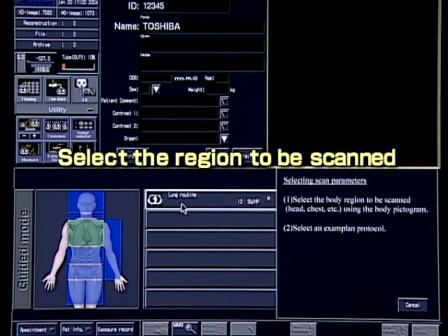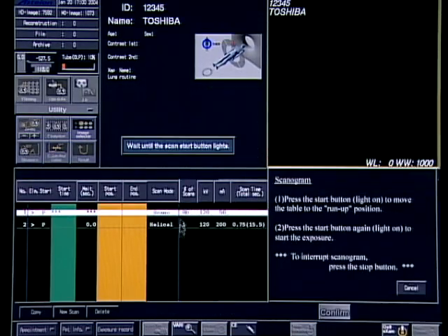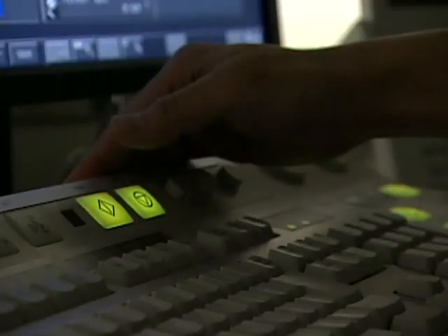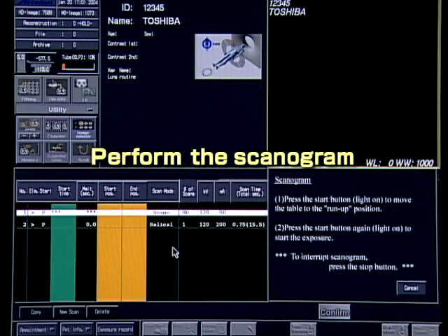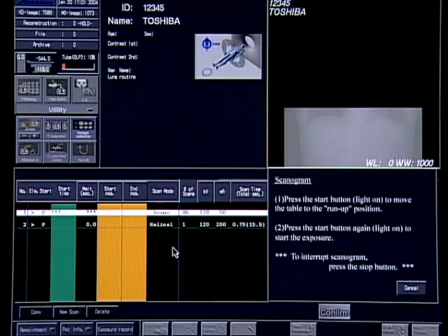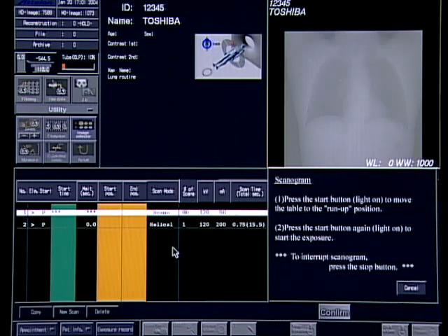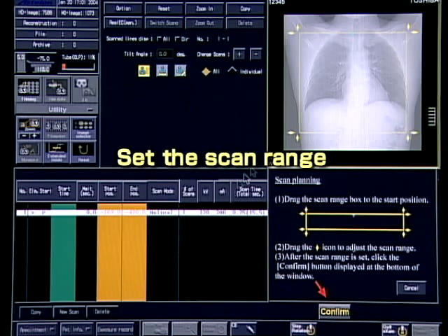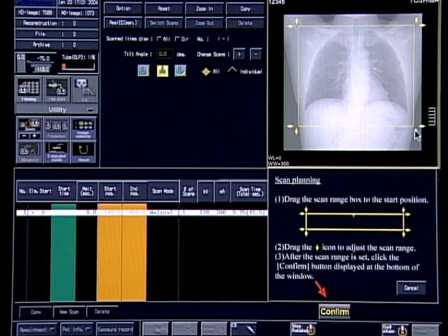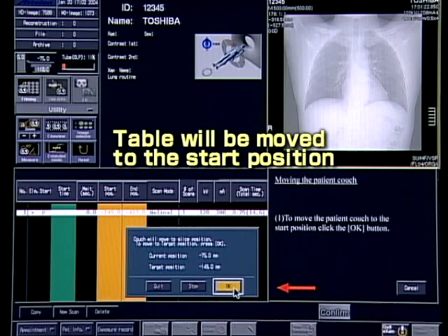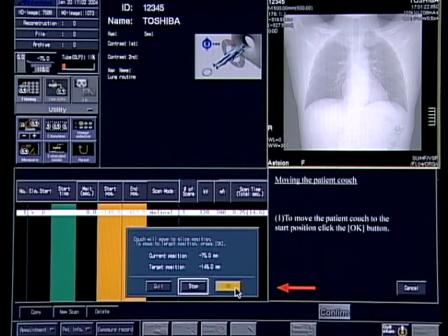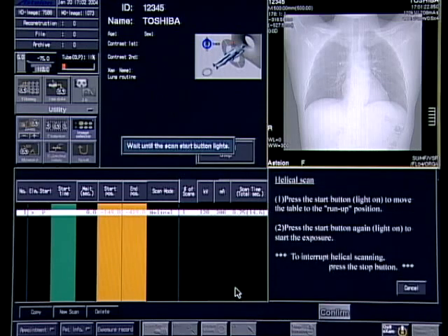Select the region to be scanned and acquire the scanogram. Next, set the scan range on the scanogram. The patient couch then moves to the scan start position and scanning is started.